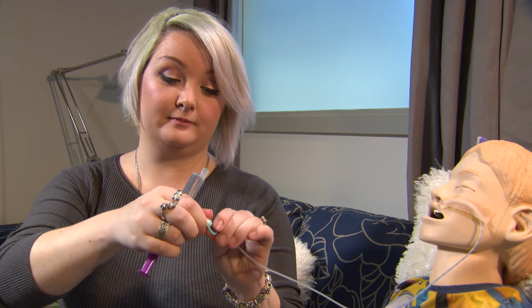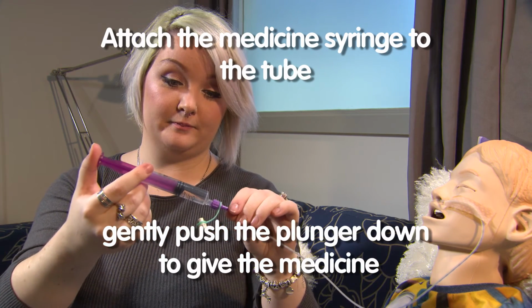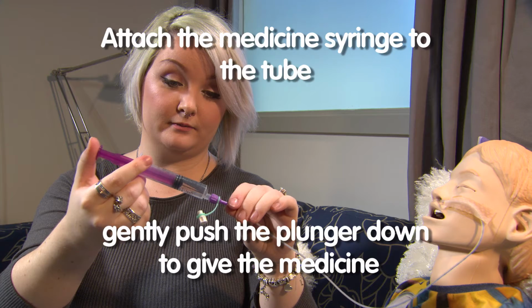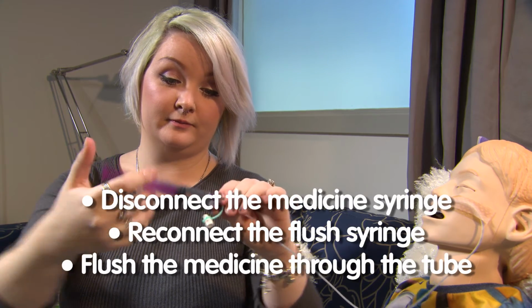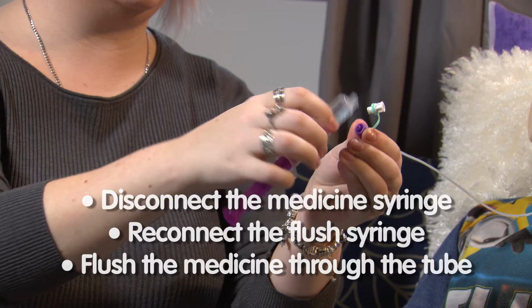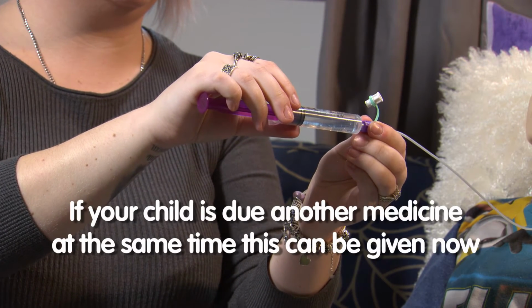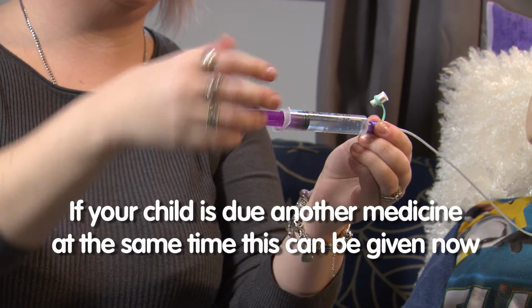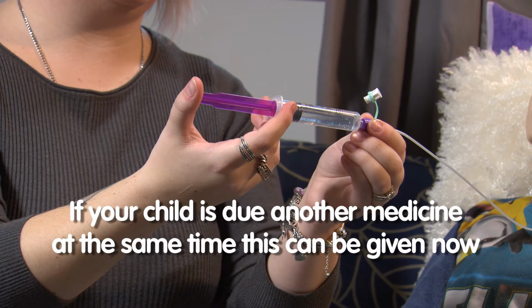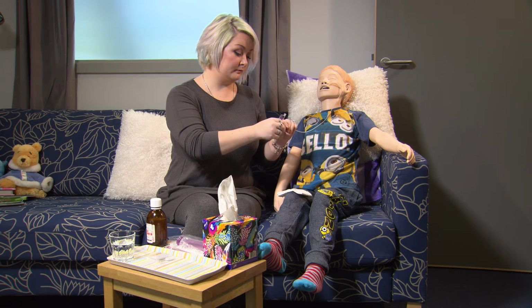After flushing, attach the syringe containing the medicine to the tube and gently push the liquid into the tube. Now, disconnect the syringe containing the medicine and reconnect to flush the medicine through the tube. If your child is due another medicine at the same time, this can be given now. You should flush the tube between each medicine with water, although this could be dependent on your child's needs. Speak to your doctor and specialist nurses to clarify this.